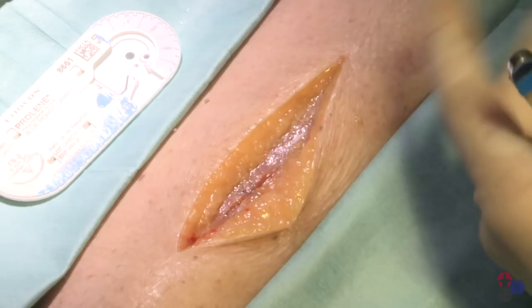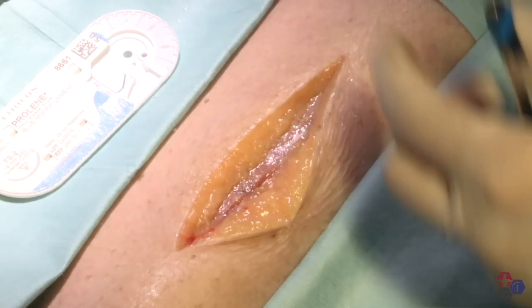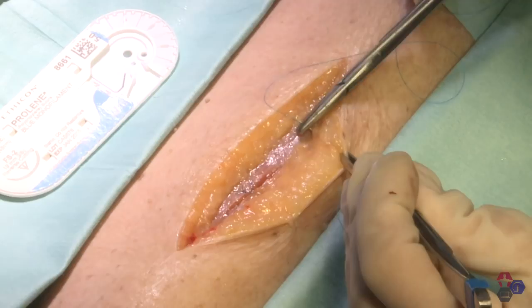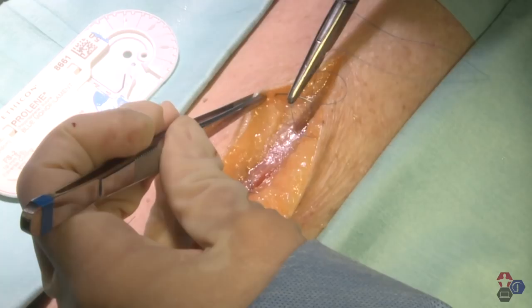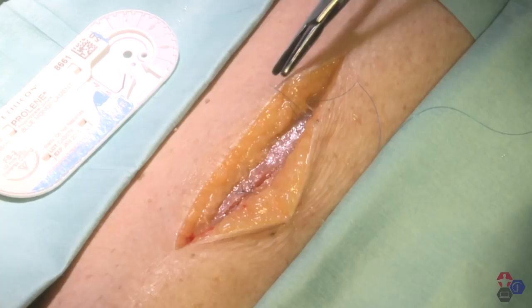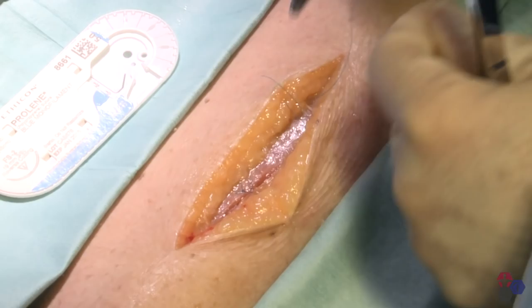Next, we're going to talk about closing the deep space in a layered manner. I'm going to use Vicryl for this purpose in real life, but we'll use Prolene for the purposes of this demonstration so that you can see the position of the suture. We want to bury this knot deep in the tissue, and we're going to place as few of these as we need to close that deep space. I'm going to begin in the deep part of the wound and come out in the subcuticular area — not at the dermis-epidermal junction, somewhere below that — and then on the other side, go from superficial to deep. I'm going to avoid making a closed loop, then make my surgeon's knot. The ends of my suture are all in the deep tissue space, not superficial.